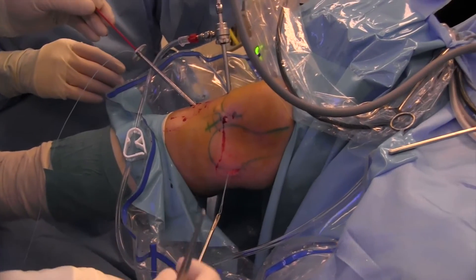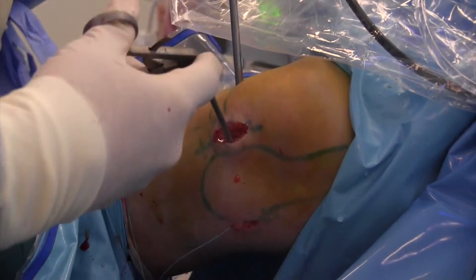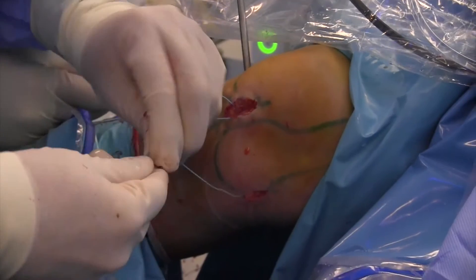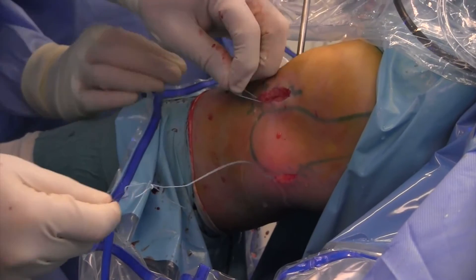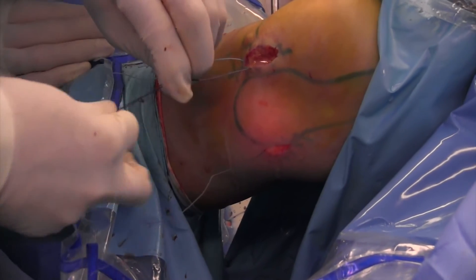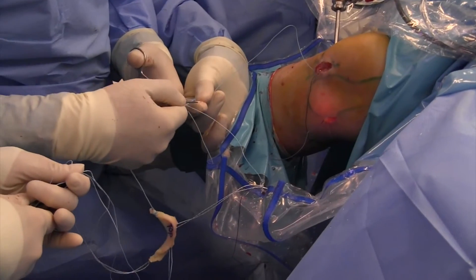Then I pull the suture through the socket, through the anteromedial incision. Then I make an arthrotomy at the front side and pull the suture out of the arthrotomy. I have two sutures — one going through the tunnel and one going through the posteromedial incision. With these two sutures, I pull the meniscus into the joint.